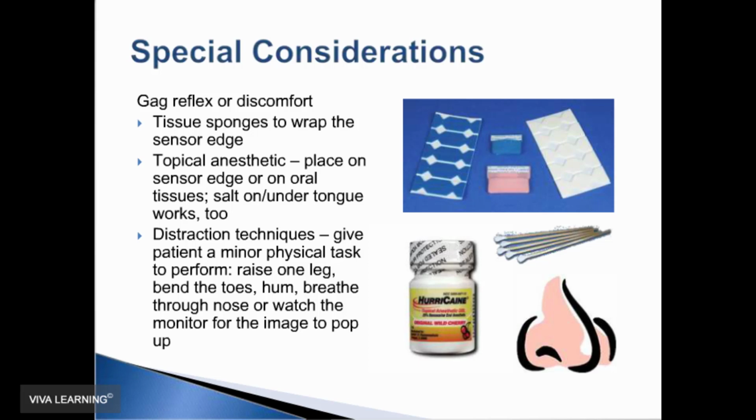Another alternative would be to have the patient bend the toes or point the toes towards their body. To keep your feet in this position really takes some concentration. You can also have the patient hum, and as I suggested earlier, have the patient breathe through their nose, or you can also have them watch the screen for the digital image, if you're using a rigid receptor, to pop up on the monitor. What we want to do is direct their attention away from gagging onto something else. Just refocus their attention.